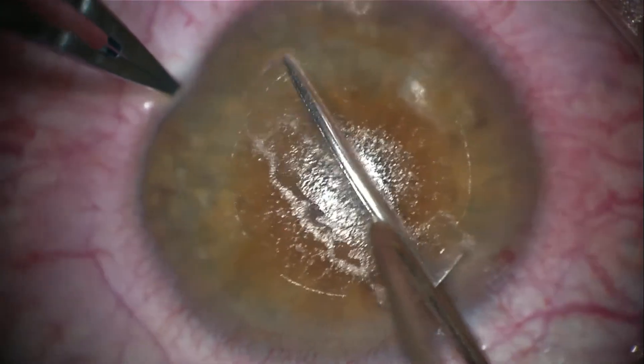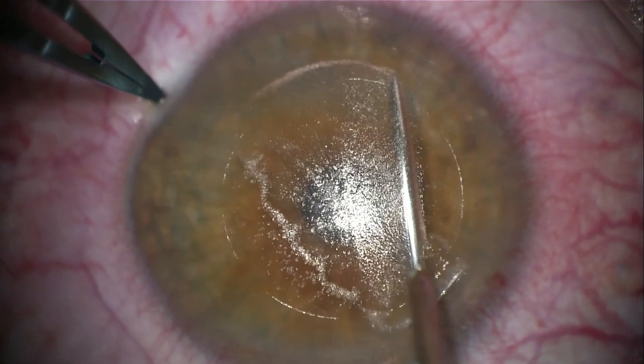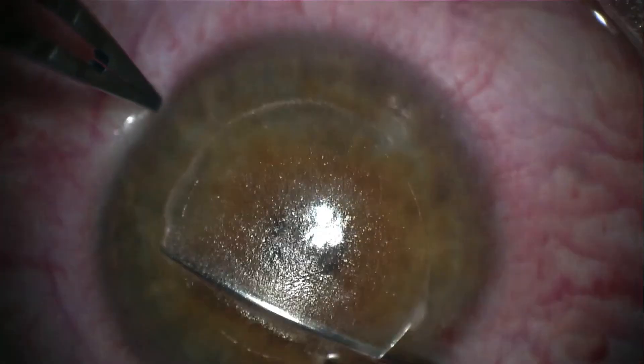Once I have reached the other side of the cap cut, I dissect towards the right all the way to the periphery of the cap cut. Then I will dissect to the left, again avoiding the center of the cornea as much as possible.